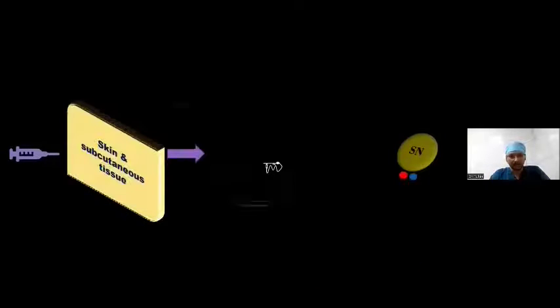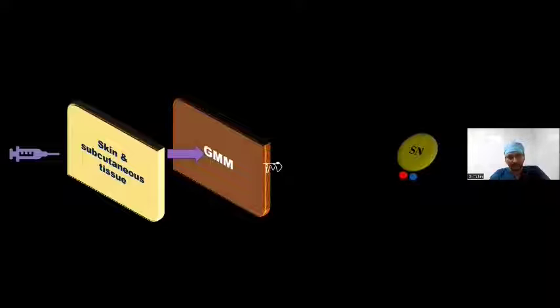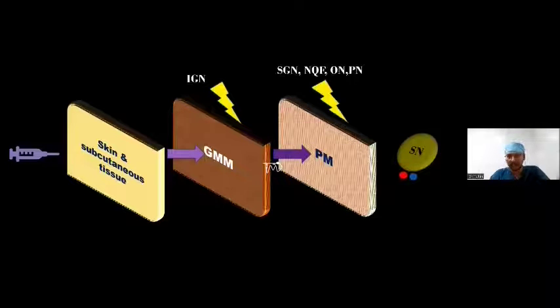Now, coming to the troubleshooting while doing ultrasound guided, dual guidance, or PNS guided. You can directly stimulate the gluteus maximus muscle or inferior gluteal nerve. You will get the gluteus maximus contraction. Just go ahead. After piercing the piriformis muscle, you might get contraction of the perianal area. Patient might complain of paresthesia or adduction because of obturator nerve stimulation. Stimulation of the nerve to quadratus femoris or superior gluteal nerve can happen. Just redirect the needle caudally and medially.